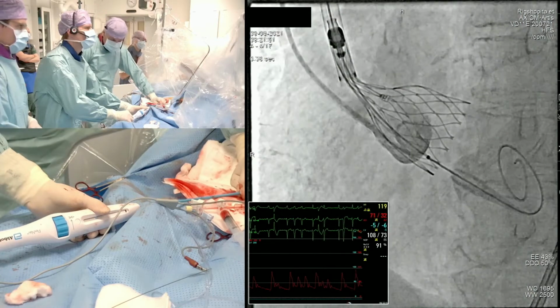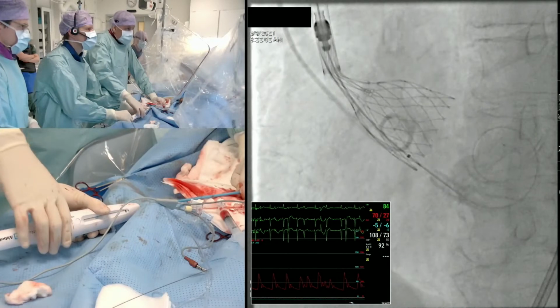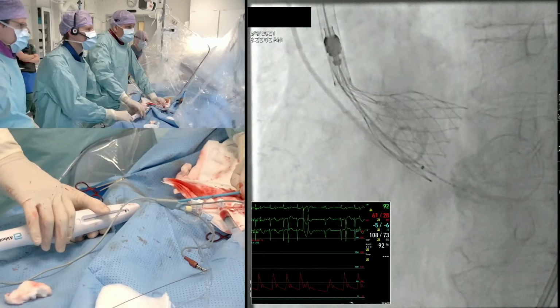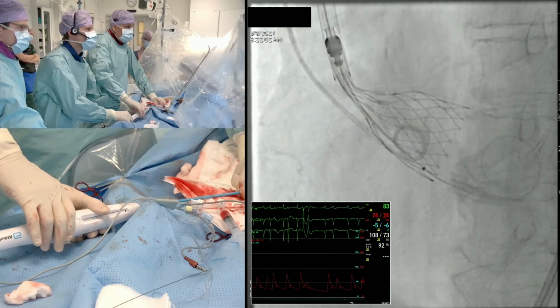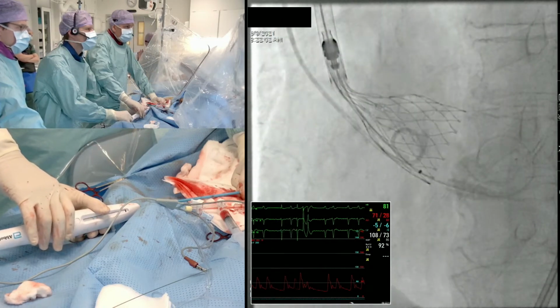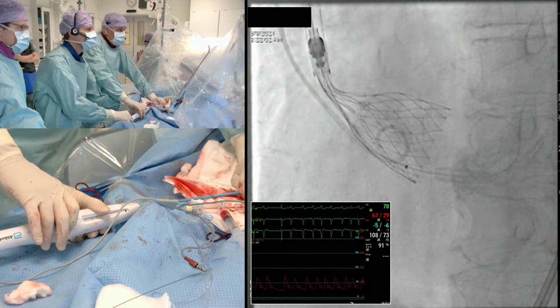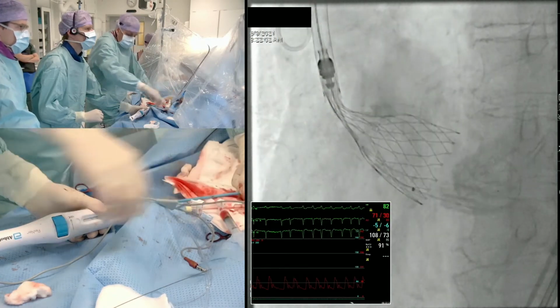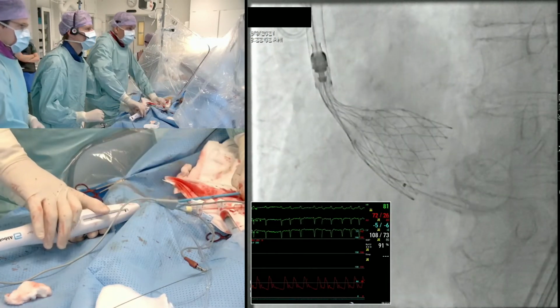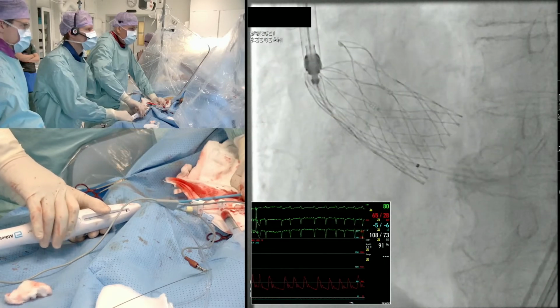Yep. So what we can do now, Ole, is that you can take some tension off the guide wire. I'll do that. I'll go a little bit further up here. And as long as you have that radiopaque ring at the end of the capsule below the metal part, you can actually still recapture if you want. So we're going to deploy here. I'm pulling the pigtail back, and we go slowly here at the last part.